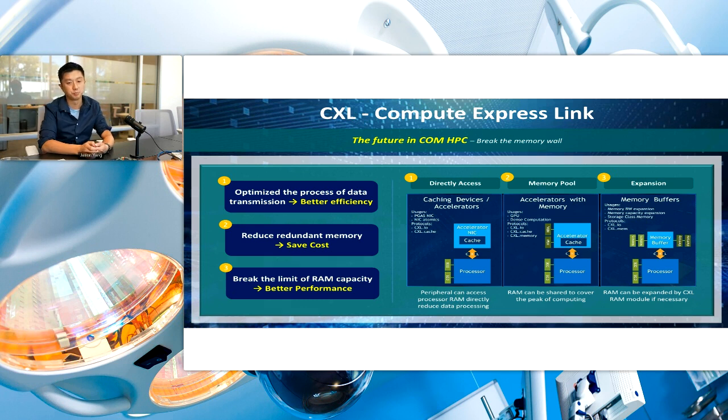So basically you can pull together all the memory and then use it as a common memory address space. Okay, so this can help you increase performance, eliminate memory bottlenecks, and then especially for use cases where you're processing large amounts of raw data, for example, medical images, this can help you exceed the regular limitations that you might be running into.